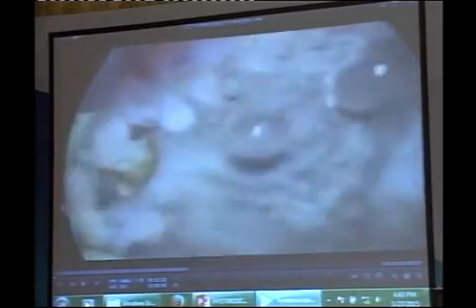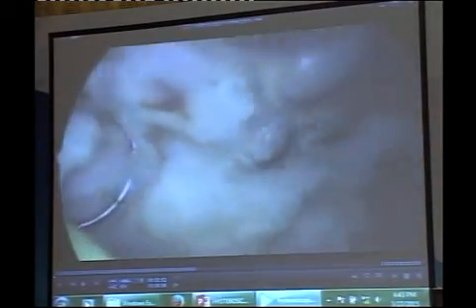A sound surgical technique is not to extend the slicing at a time for more than 15 minutes and allow deflation of the uterus in between to remove the fragments and assess the inflow and outflow and the general condition of the patient.